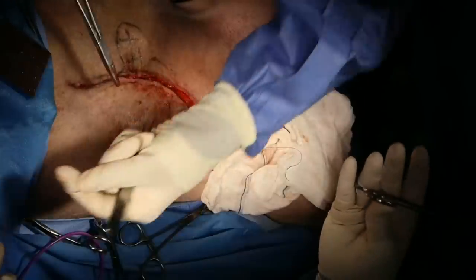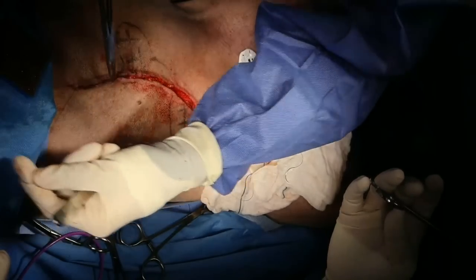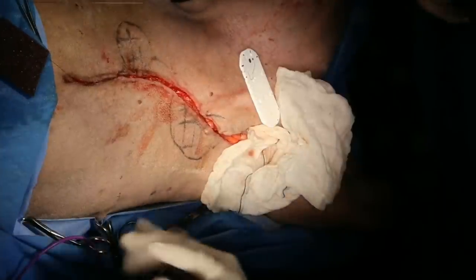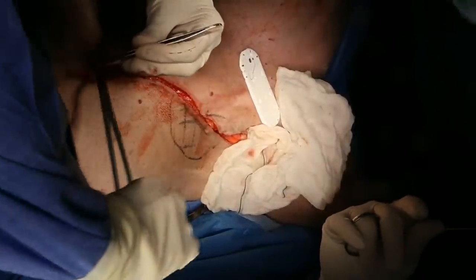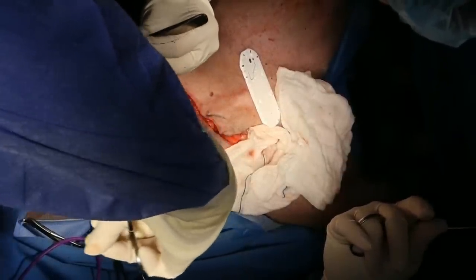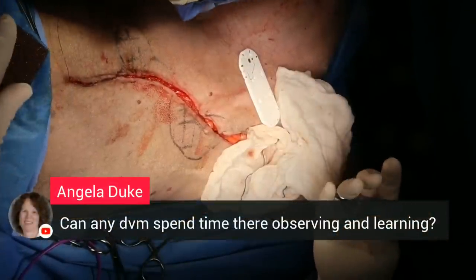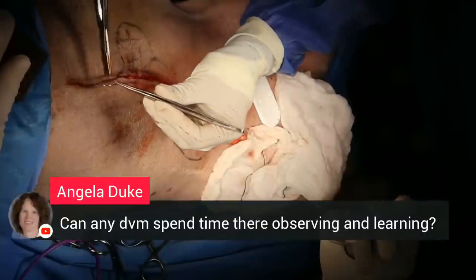So there's a comment about using sharp dissection versus cautery, misleading histopathological results, specifically the clean margin determinations. I think that if we had tumor-touching electrocautery char, then that could be misleading. But if I've got a margin of healthy tissue beyond the tumor before the electrocautery char, then I don't think that it makes any difference. There's a comment about using Nocita. I would love to use Nocita, but we don't have it available in Australia. A question about whether suturing the omentum into the body wall would further complicate further surgery if it happens. Look, maybe a little bit, except that we would just excise whatever omentum was in the way.